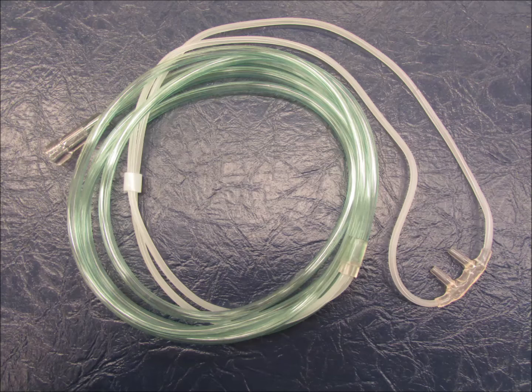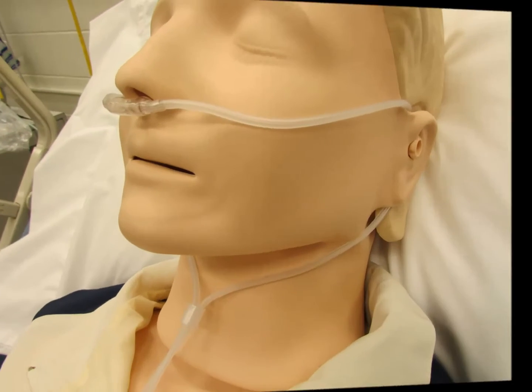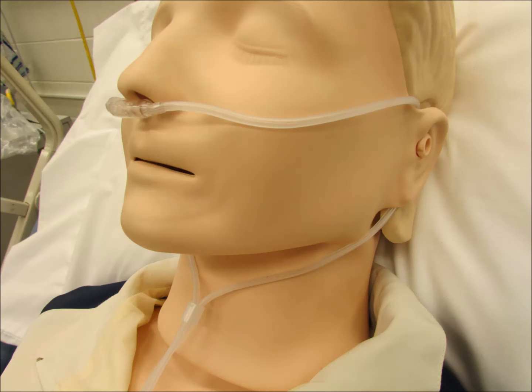This device has nasal prongs that are placed in the patient's nares to provide supplemental oxygen to the room air that they breathe. You place the prongs into the nares, angling back, following the natural curvature into the nasal passages. The tubing then goes behind the ears and back around to the front of the patient to cinch up under their chin. This will hold the nasal cannula in place.